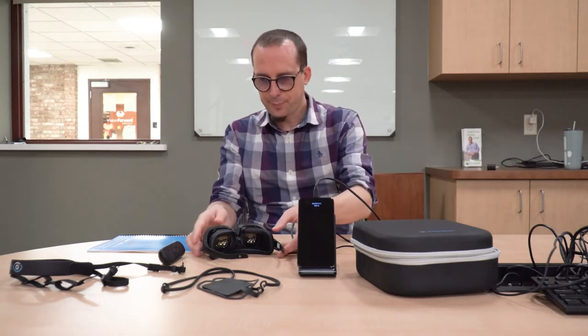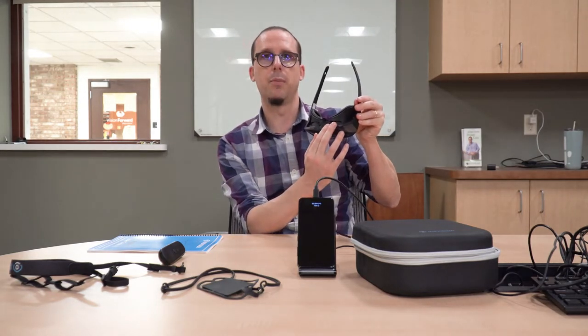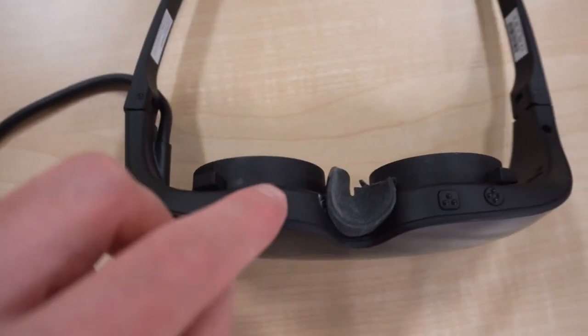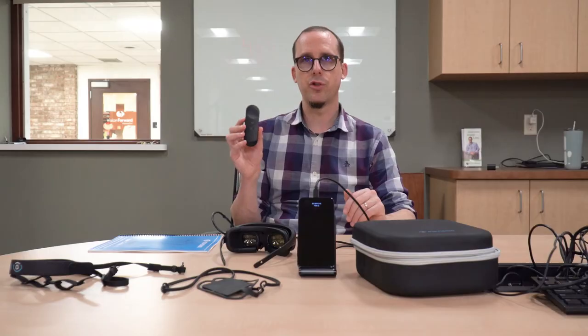In terms of controls, we have a number of ways to control the IrisVision Inspire. We have four buttons located underneath the lenses, which can be used to carry out all the different functions of the device. We also have this remote control, which controls all functionality. And we can also use voice commands - we can give voice commands to zoom in, to change modes, adjust brightness, and things like that.